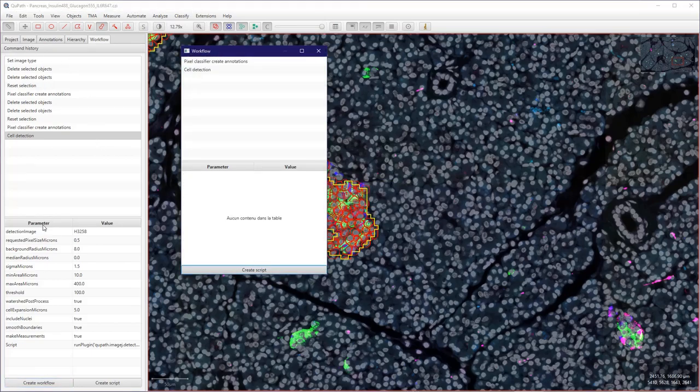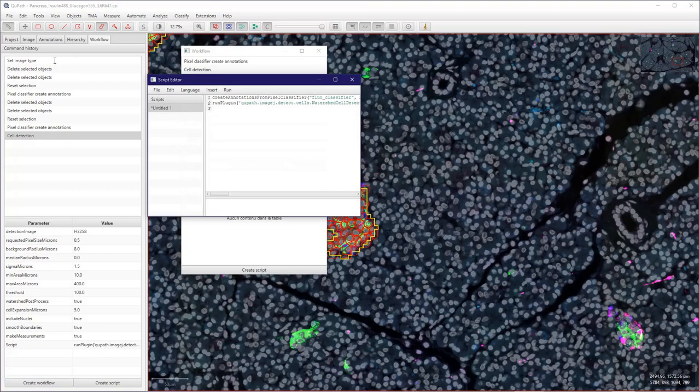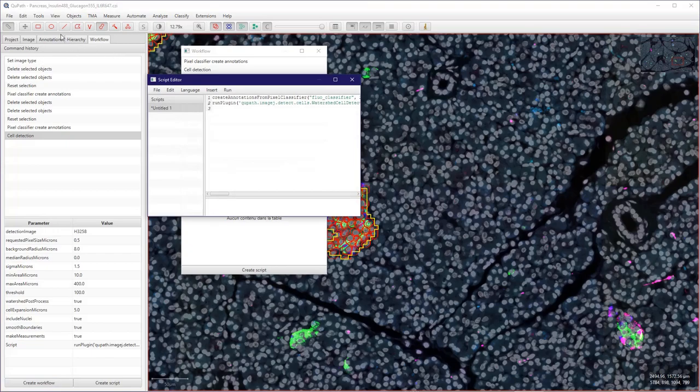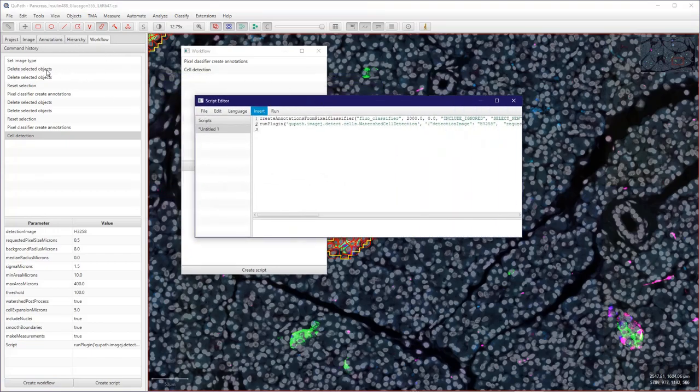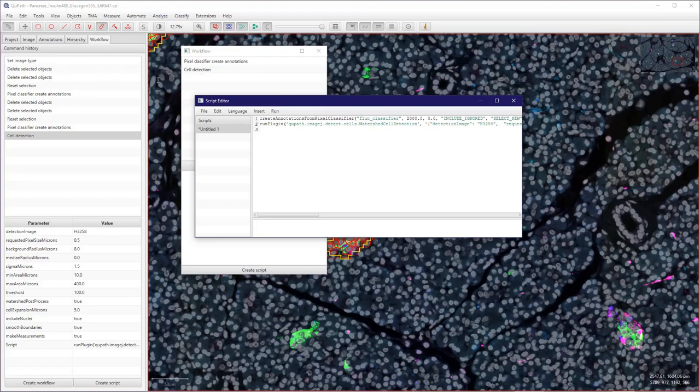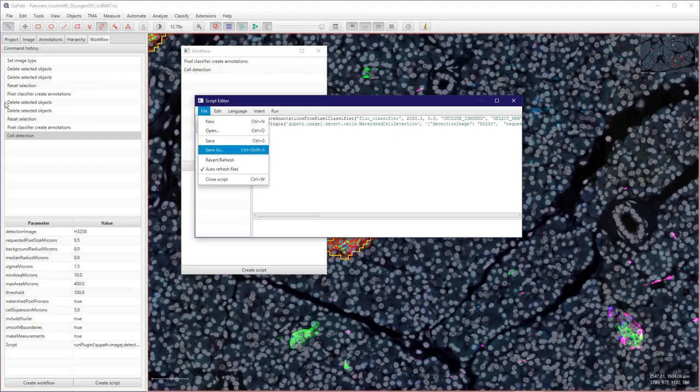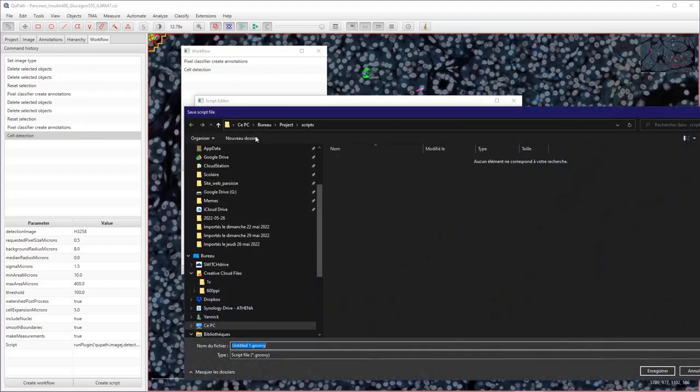And now I can create a script here where I will just call my pixel classifier, which is a threshold, and directly after that do a cell detection. So I will save this as, let's call this my script.